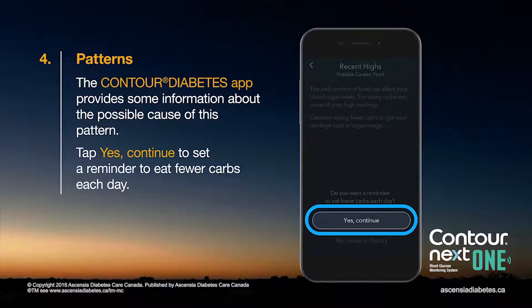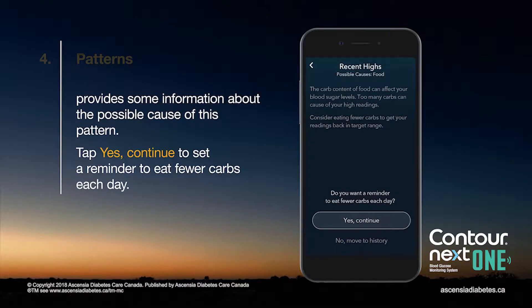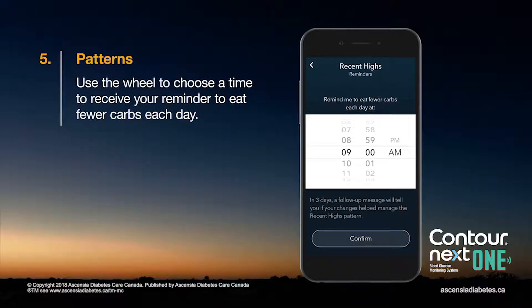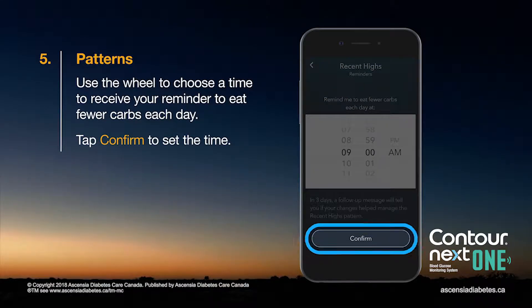Tap Yes, Continue to set a reminder to eat fewer carbs each day. Use the wheel to choose a time to receive your reminder to eat fewer carbs each day. Tap Confirm to set the time.